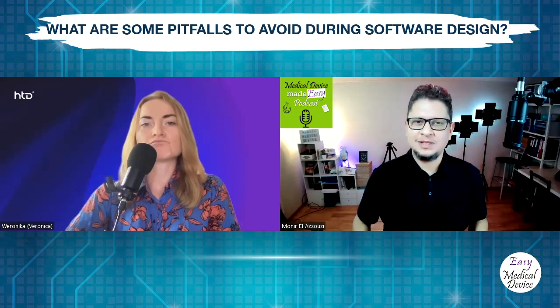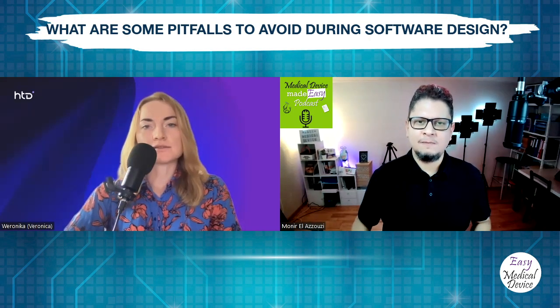So Veronica, can we start with the first one? I think we listed the first one as risk management. So what can we say about risk management for software as medical device? Definitely, Monir. Great point. Yes. So risk management, as we know, everything in medical device is risk-based, right? So it's very crucial to start risk management activities since the very beginning of the project. But what I've been seeing throughout my career is that very often risk management is treated as a checkbox activity, like some people just want to do it once and forget about it.